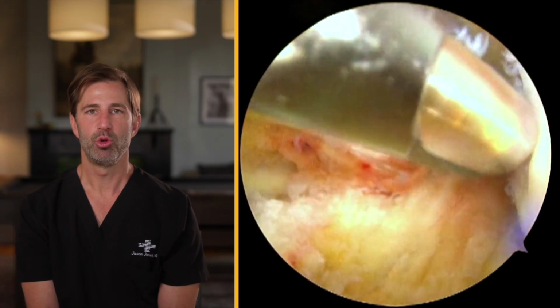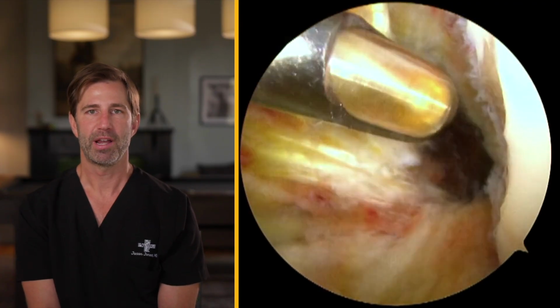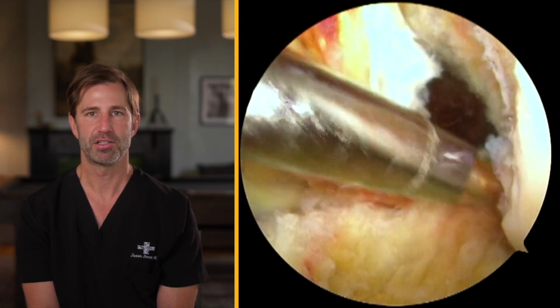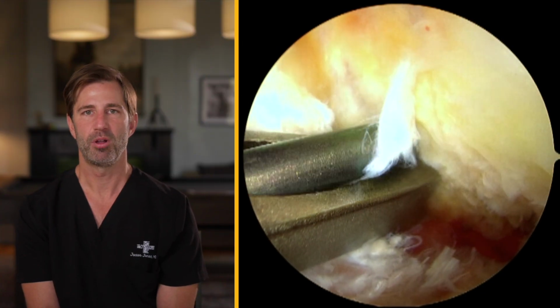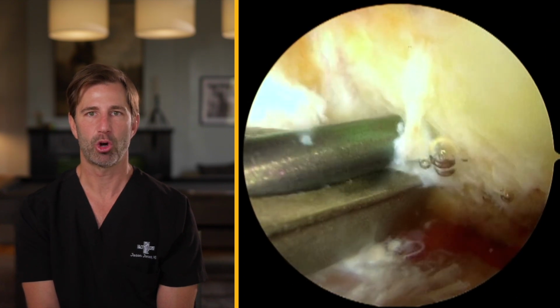At this point, we've removed the ACL. We're also opening up space for the new ACL to reside. We've created an opening on the anterior aspect of the lateral femoral condyle and allow us to have better visualization to the joint itself. We'll then measure a position roughly 7 millimeters off the back of the lateral femoral condyle itself. A pin can be shot up into this point to act as a marker.